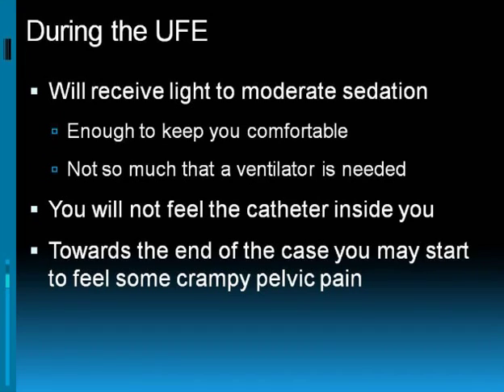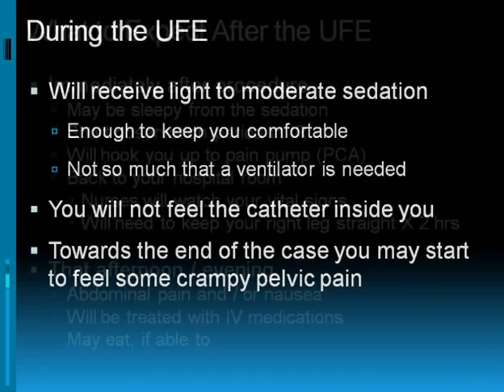Aside from the initial time where we put the needle into the skin to numb the skin, you won't really feel the rest of the manipulations. You do not feel the catheter as it moves through your arteries. Now, towards the end of the case, you may start to feel some crampy pelvic pain, and this is just the body's response to having these fibroids killed. It has nothing to do with the actual manipulation of the catheter.